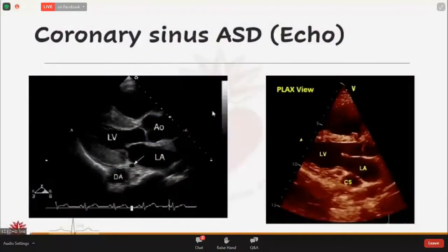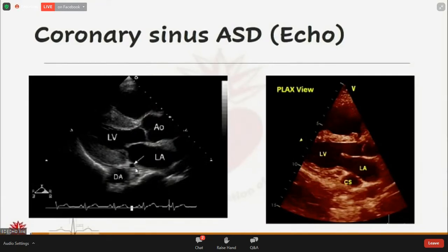In the parasternal long-axis view, in a normal patient it appears as a circular structure. This small circular structure is the coronary sinus, and this is the descending thoracic aorta. In my case, however, the coronary sinus is hugely dilated.